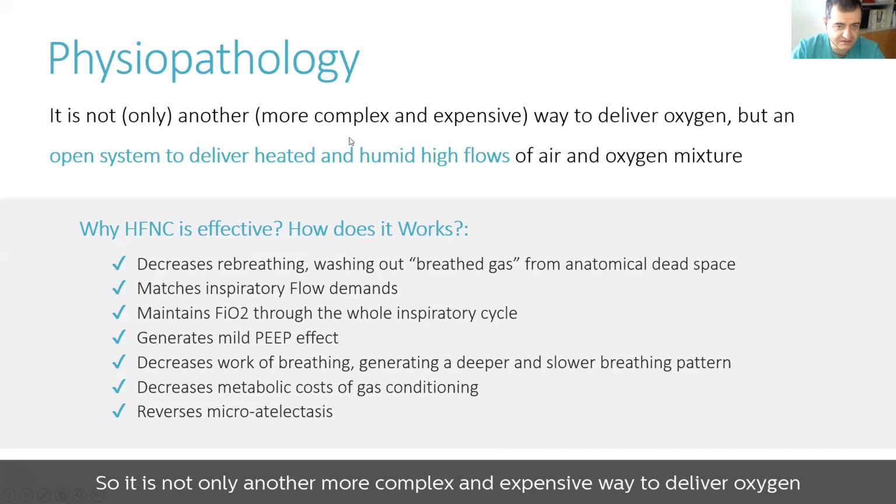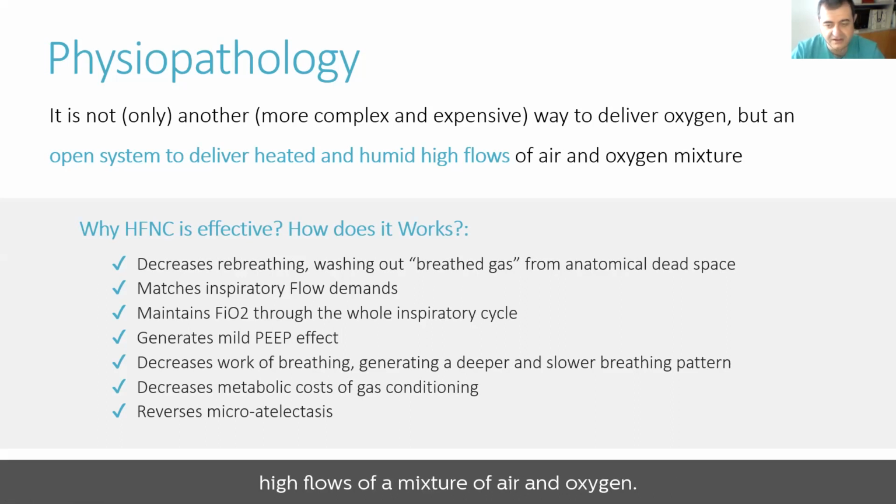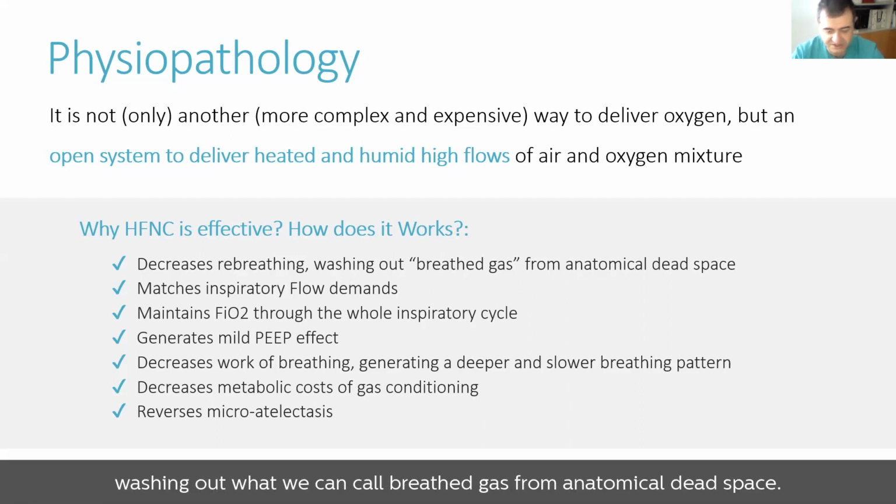So it is not only another more complex and expensive way to deliver oxygen, but an open system to deliver heated and humidified high flows of a mixture of air and oxygen. And it is effective because it works by decreasing rebreathing, washing out what we can call breathed gas from the anatomical dead space.